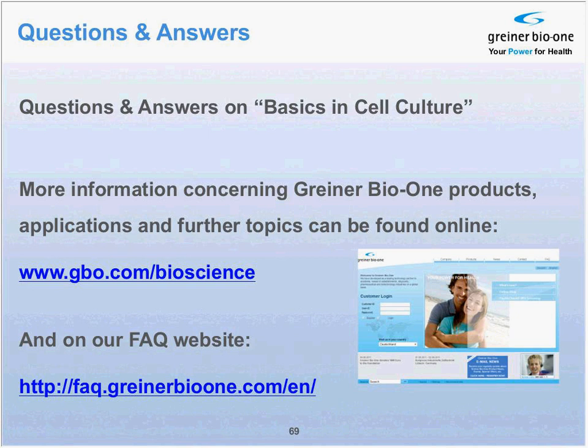Okay. And can you go over briefly the pros and cons of filtering media after the addition of supplements? Mm-hmm. One, I would like to stick to the last question. One important point is that we recommend only the storage of the cryo vials in the gas phase of liquid nitrogen. And to my knowledge, this is what all manufacturers actually recommend, because this decreases the likelihood of liquid nitrogen entering the tube. So maybe this was also part of the problem. So I apologize.